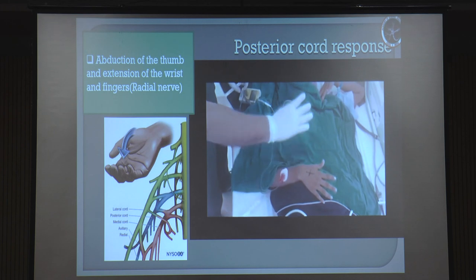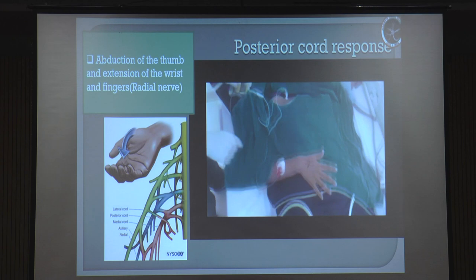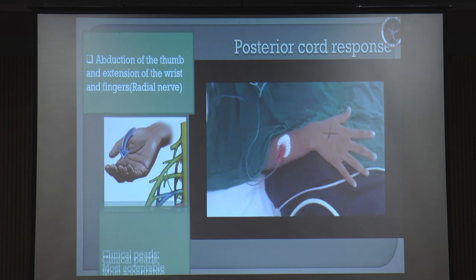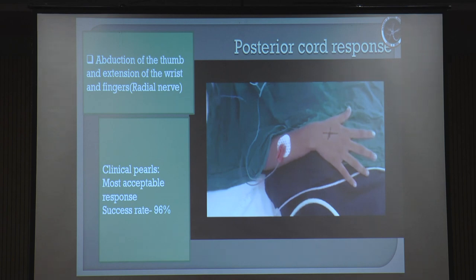This is a posterior cord response - extension of the cord. Always go for a posterior cord response as an acceptable response. If you are getting wrist extension, try to get finger extension, because the posterior cord response is the most acceptable response. The success rate with posterior cord response is almost 96%. So search for posterior cord response if you are getting a lateral cord response. And if you are getting a posterior cord response, don't waste your time searching for any other response.